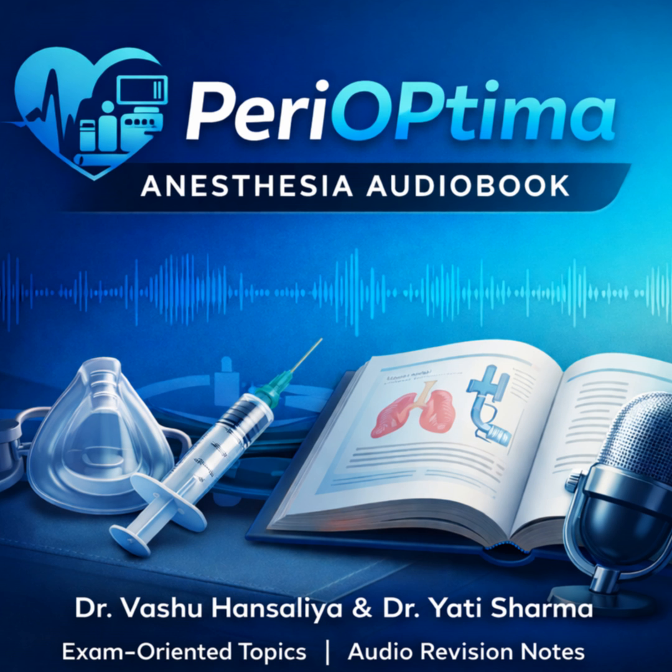In theory, yes. It features an integrated bite block and a GDC. And to prevent the epiglottis from obstructing it, its cuff has molded fins. Performance-wise, it pushes the limits even further, achieving seal pressures up to 37 centimeter H2O.